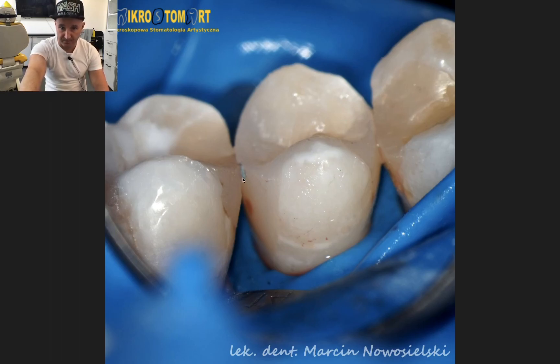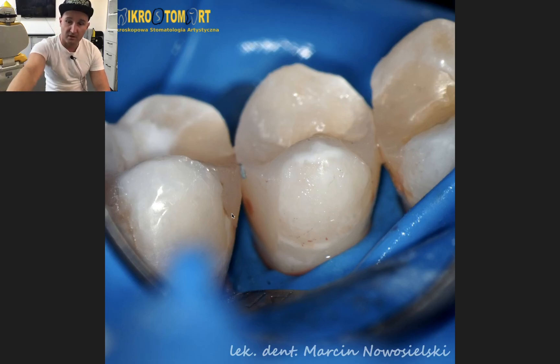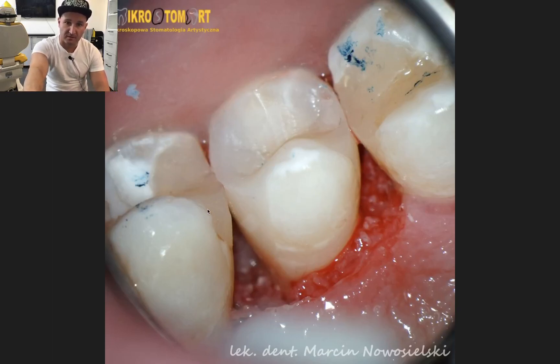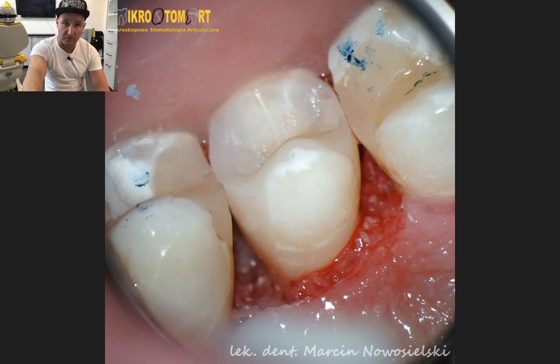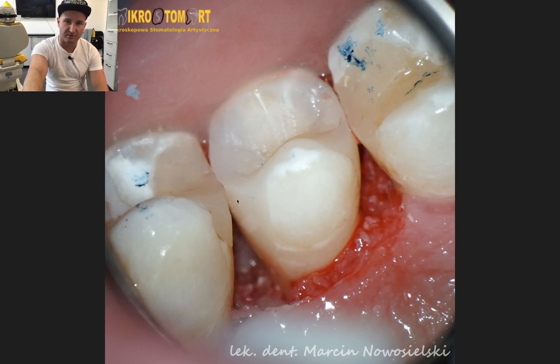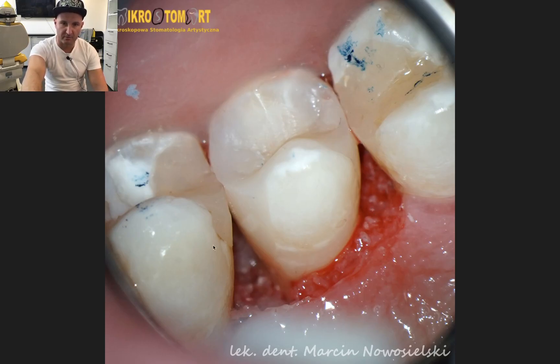Here you can see how the entire tooth looks restored. Due to the extent of the destruction, it will of course be crowned — but after finishing the entire restorative treatment. That's why we wanted to restore our contact points perfectly without any overhangs, because the patient will have to function with this restoration for a couple of months. We didn't want to cause any inflammation, so our aim was to create perfect contact points. This is the gingiva after gingivectomy.